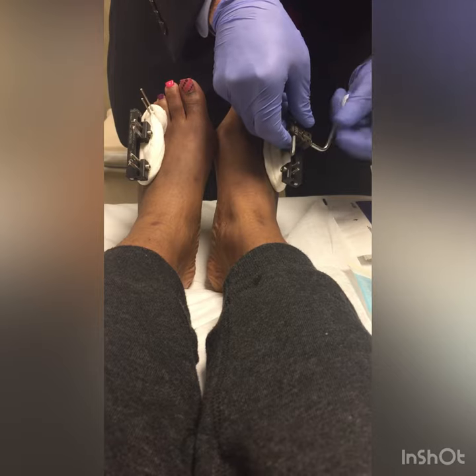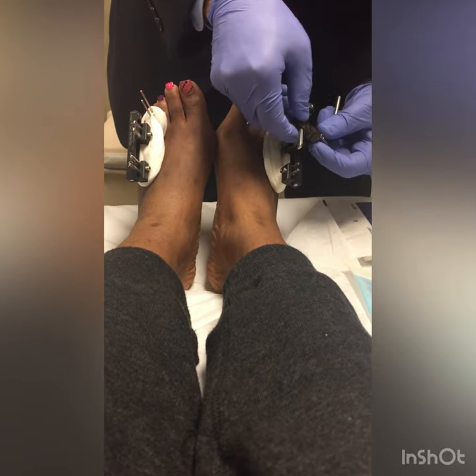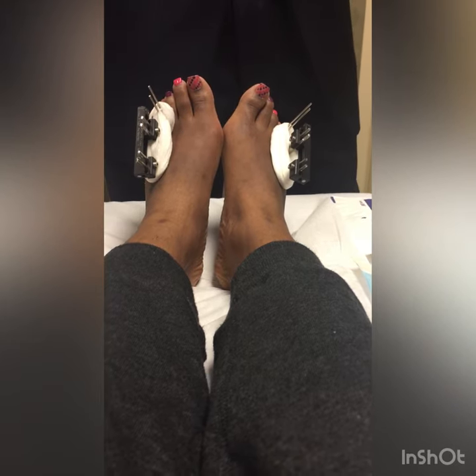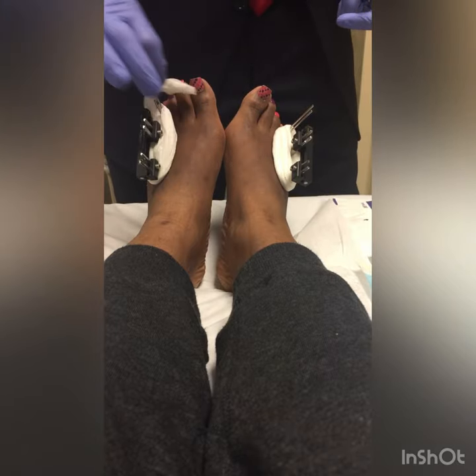This is called a piggyback, where you piggyback it. What that did is as you lengthen the metatarsal, so did the toe lengthen, and then you can also differentially distract the joint if you want.